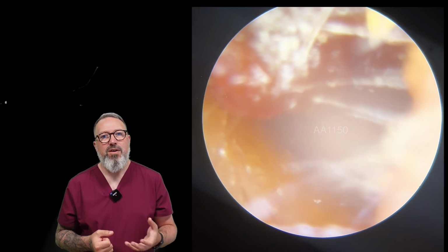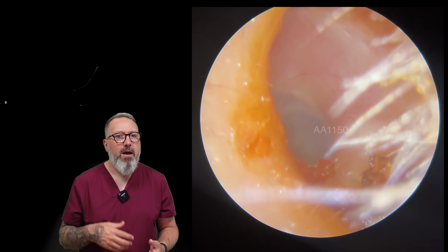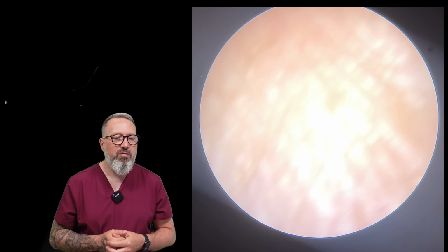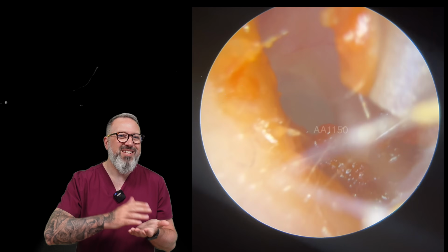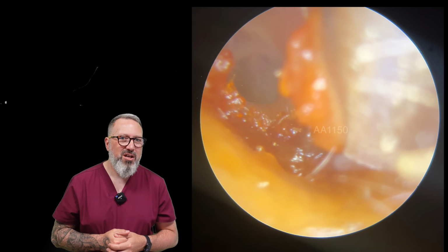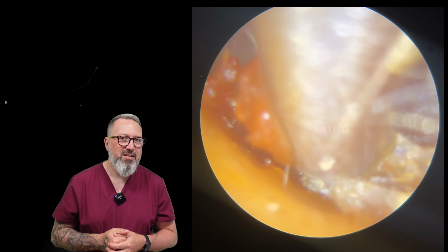So what we have here then is a much softer, stickier type of wax for Taylor, which usually takes a little bit longer to remove. They're not always as easy to remove. Sometimes if you're lucky, there's a bit of dry skin underneath and it will peel up really nicely. But yeah, you can see just how thick and sticky that is there.